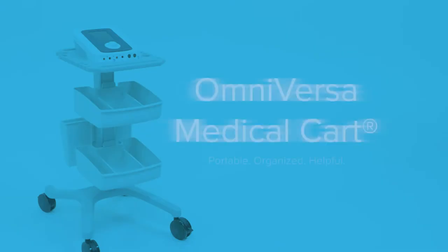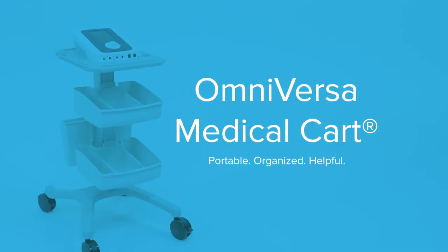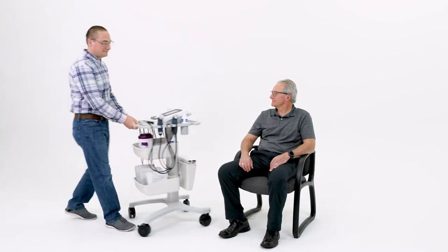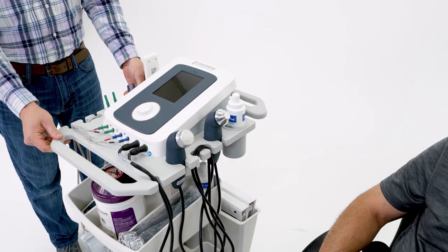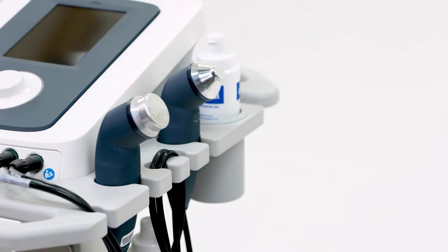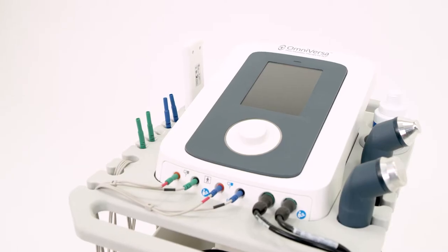The OmniVersa Medical Cart by ACP brings a new look and level of efficiency to your facility. Designed specifically with the therapist in mind, this compact portable cart offers a number of features that allow you to keep it clean and organized while using the ACP OmniVersa electrotherapy and ultrasound system.